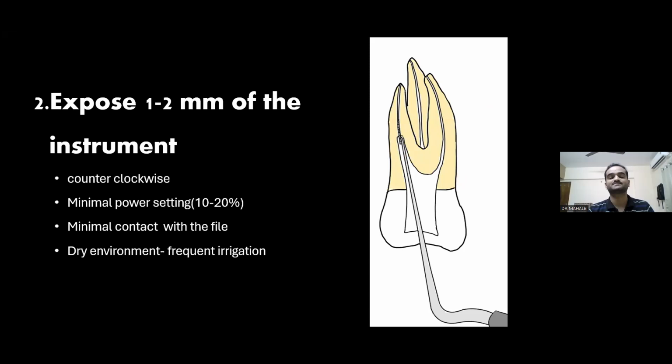according to a study, whenever the file is loose in the coronal segment and there is no supporting dentinal wall opposite to the area where the ultrasonic file is used, there are increased chances of secondary fracture. So in this stage, we are removing the dentin around the file circumferentially, so there is no wall against the file in the coronal 1 to 2 mm of the fragment.